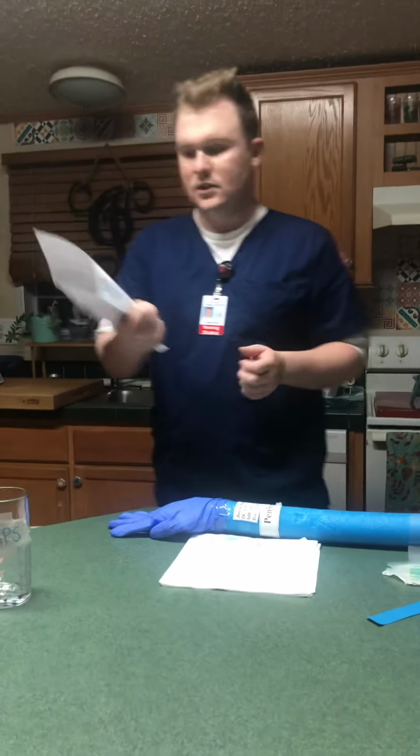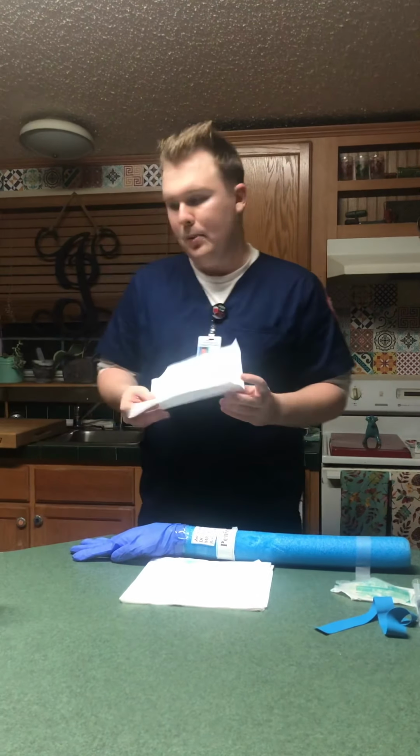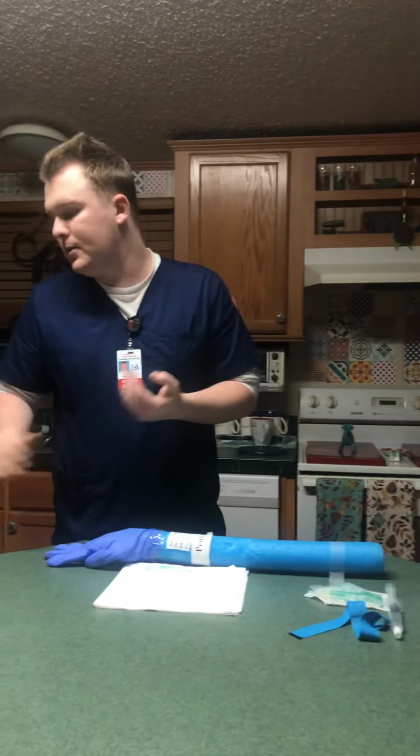Okay, so the first step is going to be to verify the physician's order and verify hospital policy. Here's the physician's order, and there's an order to insert a saline lock in the AM for a CT scan. I'm going to verify hospital policy. I'm going to gather all of my equipment, have it with me, and perform hand hygiene.